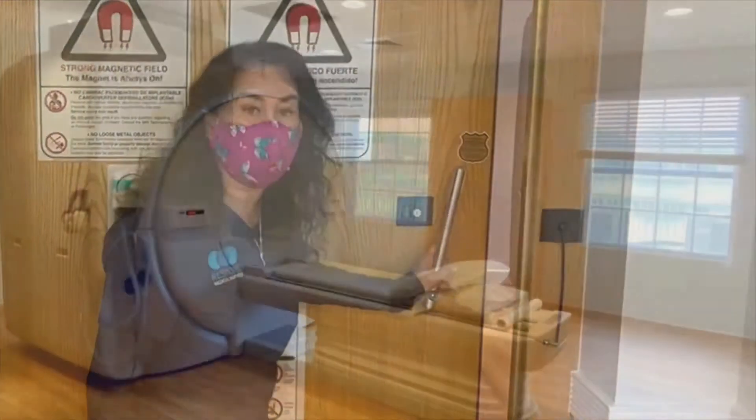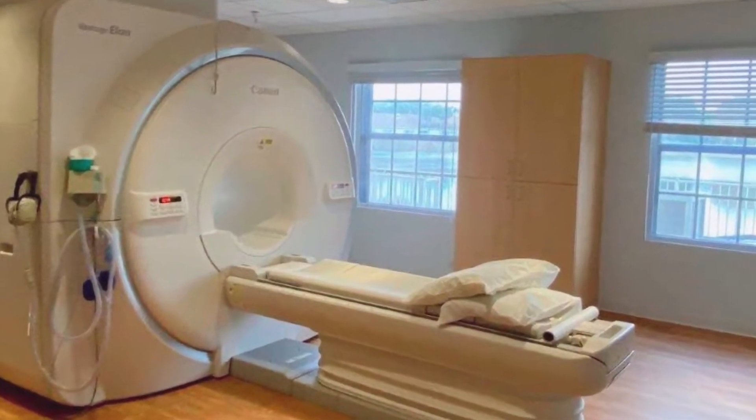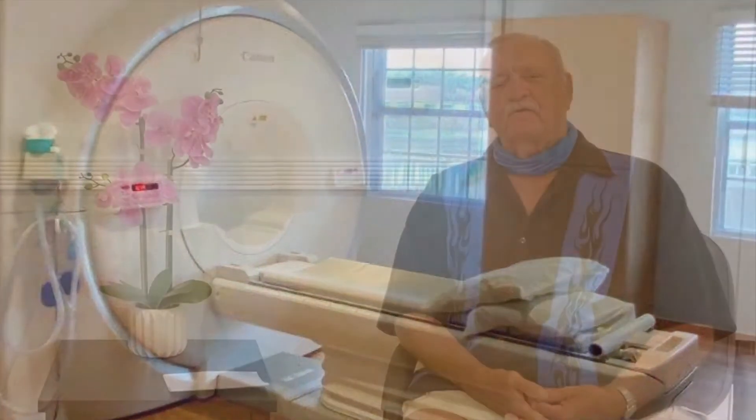When you first step into the room, they do make you feel comfortable. When you get on the machine, they make sure you're positioned right and you're comfortable. When they slide you into the machine, I think the most important thing is to put yourself in a position where you don't have to move.